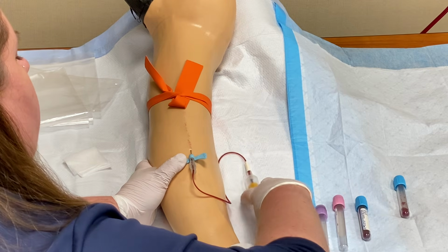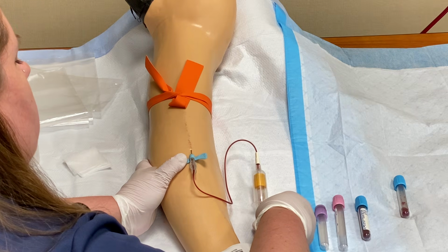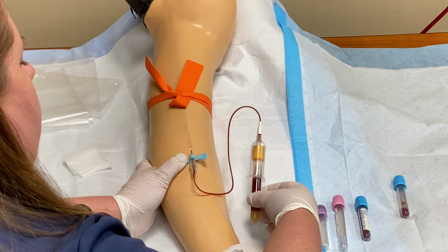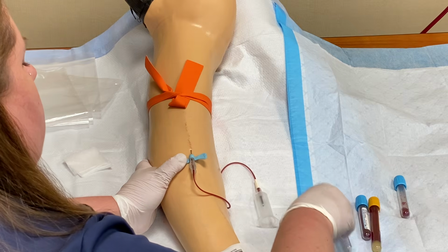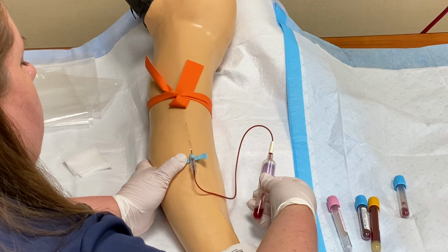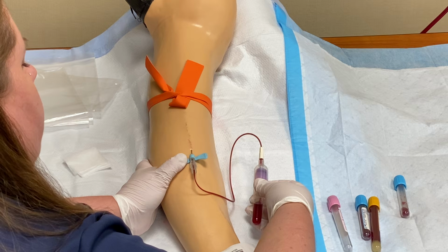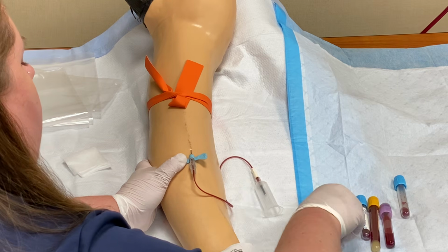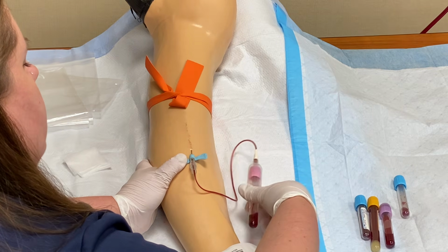Then I'm going to continue to fill my tubes in the order of the draw. So blue, gold, lavender, and pink. Final tube. Gonna let this fill up.